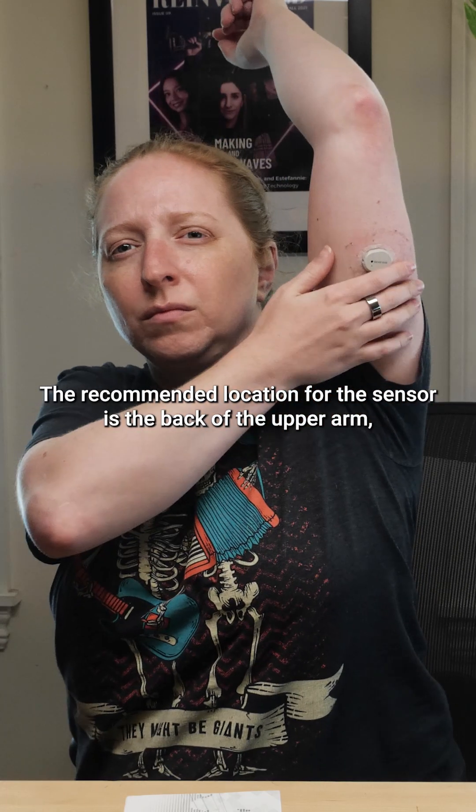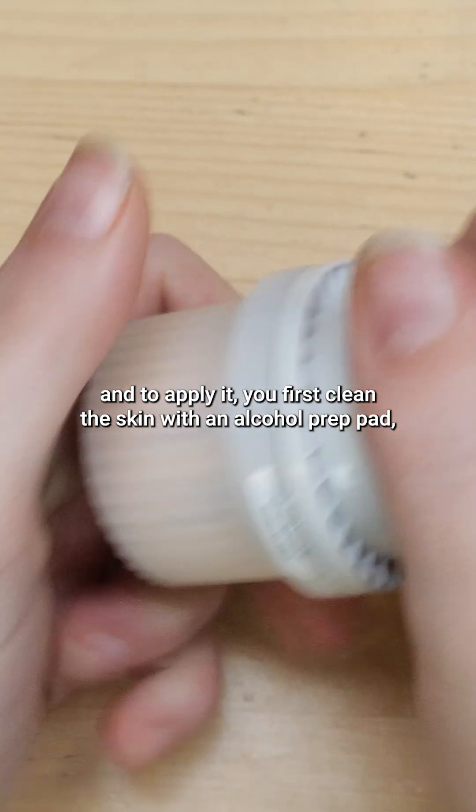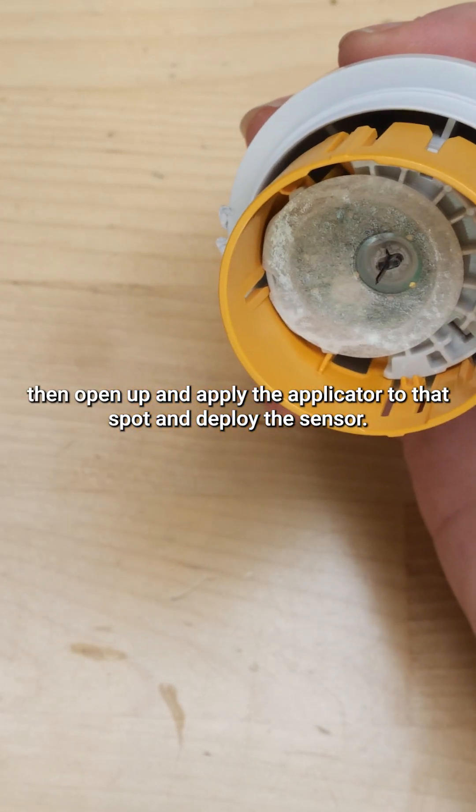The recommended location for the sensor is the back of the upper arm. To apply it, you first clean the skin with an alcohol prep pad, then open up and apply the applicator to that spot and deploy the sensor.